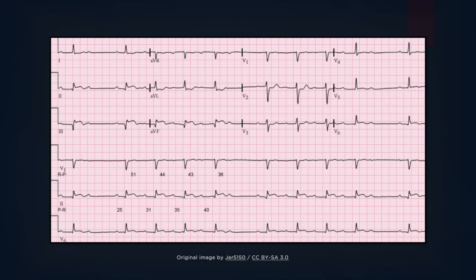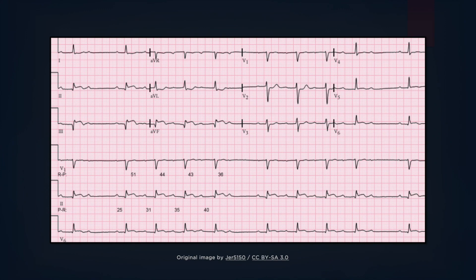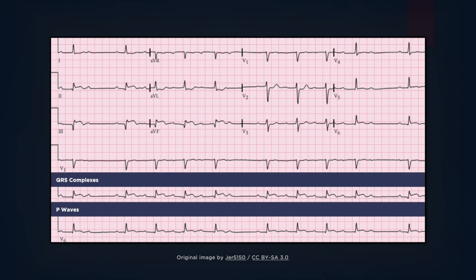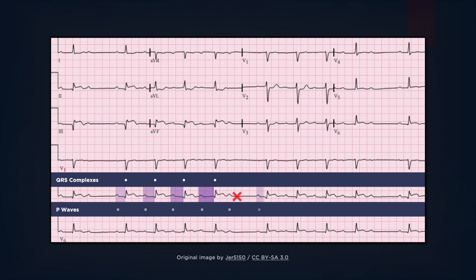In this ECG, we are going to focus on lead 2 where the P waves are best visualized. The PR intervals are gradually increasing until a P wave fails to conduct and results in a dropped beat. This pattern is characteristic of Mobitz 1. Note that within each cycle there are 5 P waves and 4 QRS complexes. Hence the AV conduction ratio is 5 to 4.